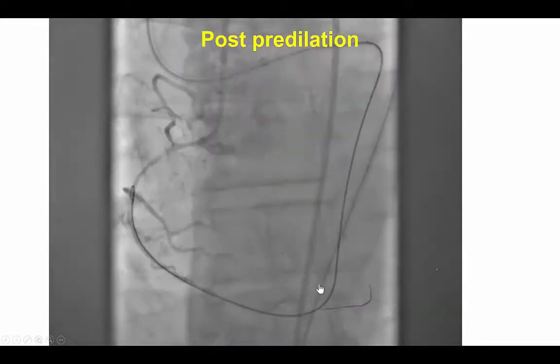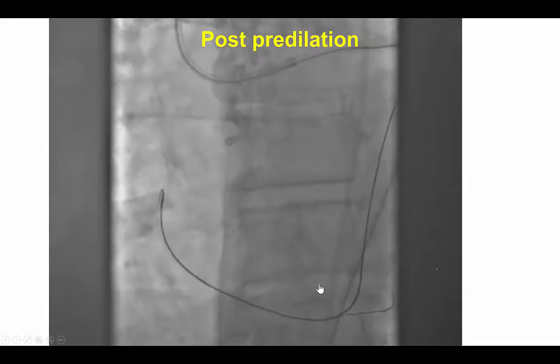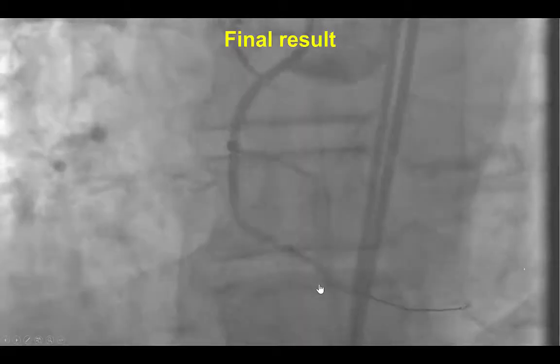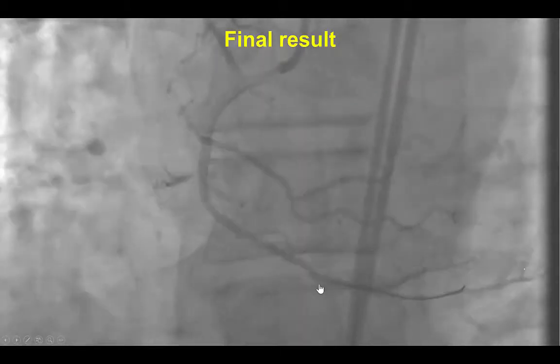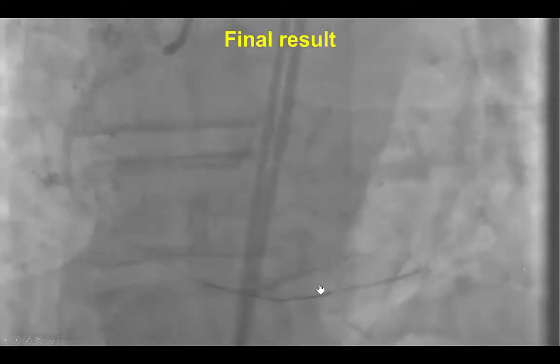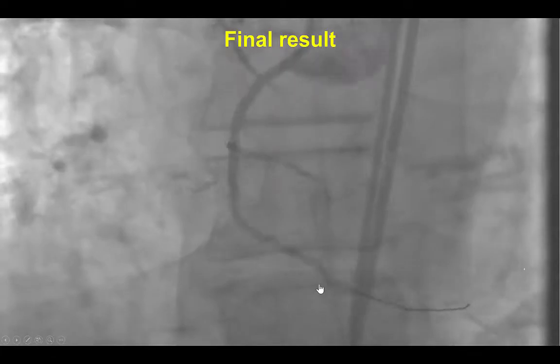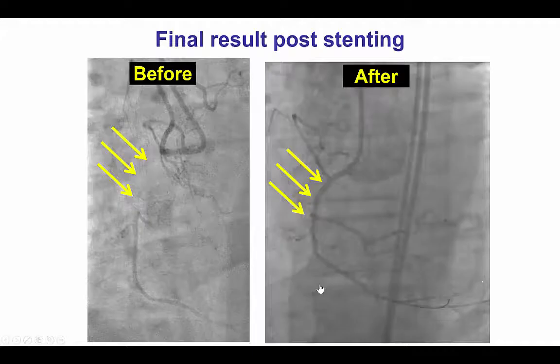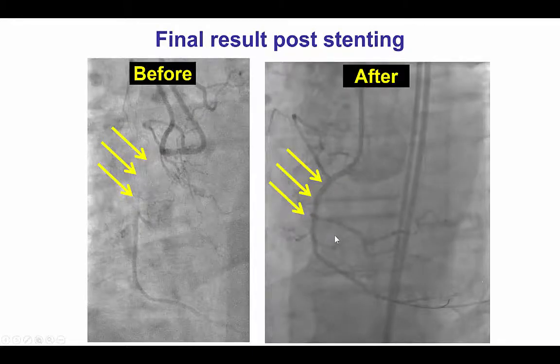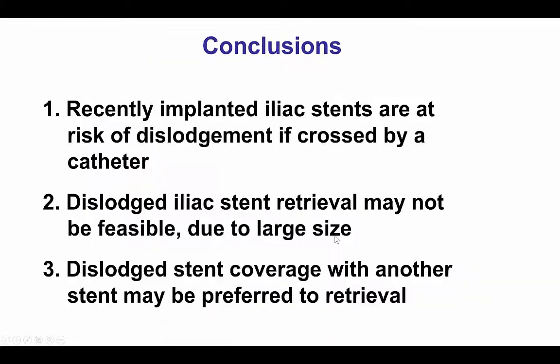The occlusion was ballooned, and then after placing stents, a nice final result was achieved — the vessel before and after with nice re-canalization.